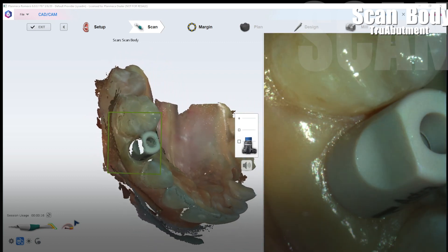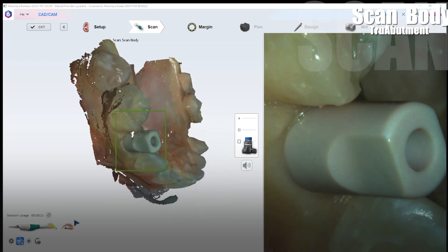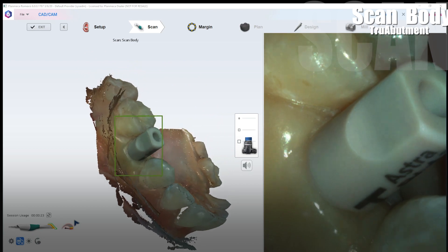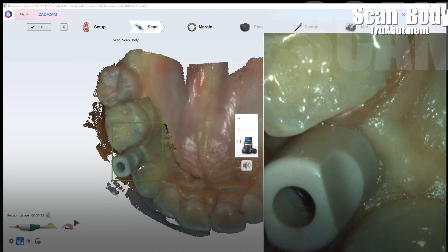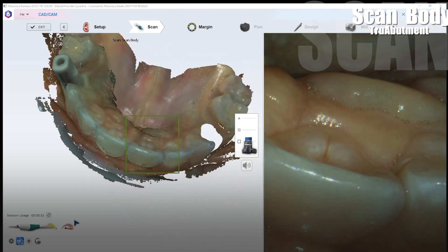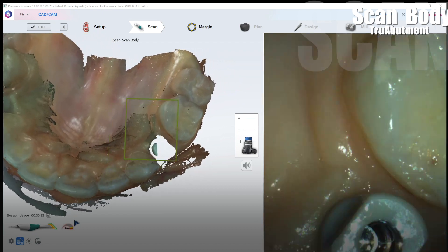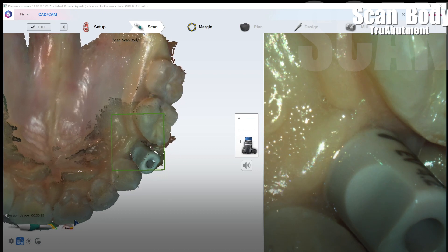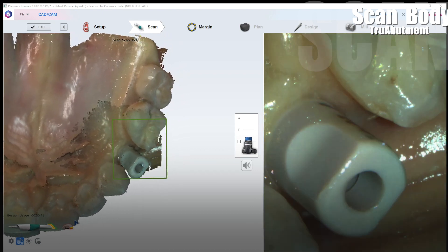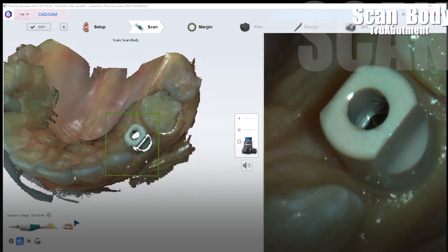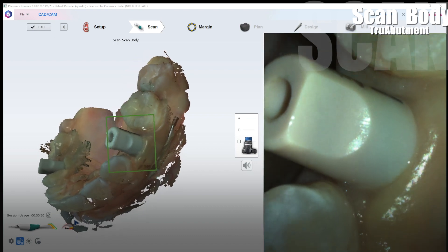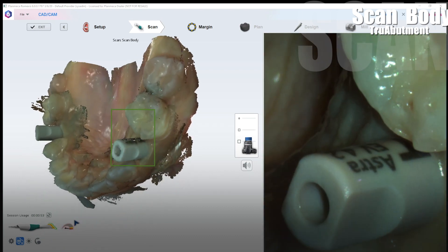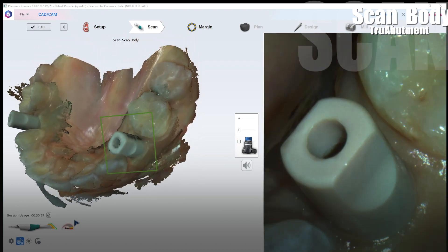Actually in this case it looks like it's an Astro implant. So what we're going to do here is fill in as much data as we can. And we're making sure that we recapitulate a little bit over the arch as we go to the other side. And all that data is going to be merged together with our soft tissue scan for the laboratory to be able to design proper emergence profile of these restorations. In a later video I'll show you how to go ahead and design these yourself if you want to in ExoCAD, PlanCAD Premium.